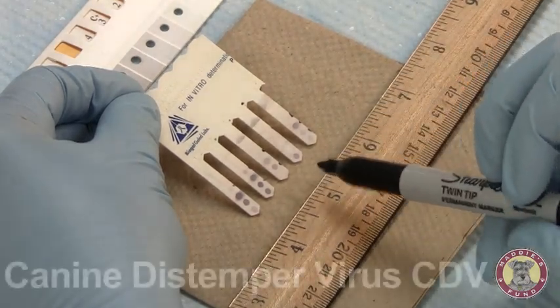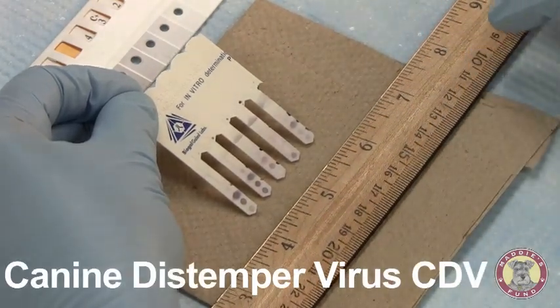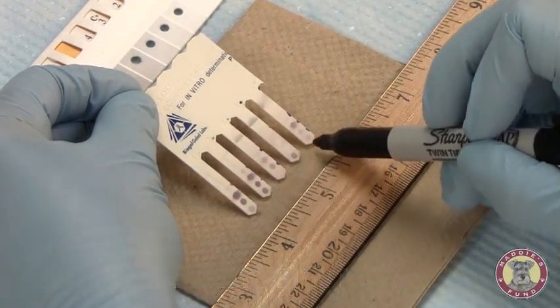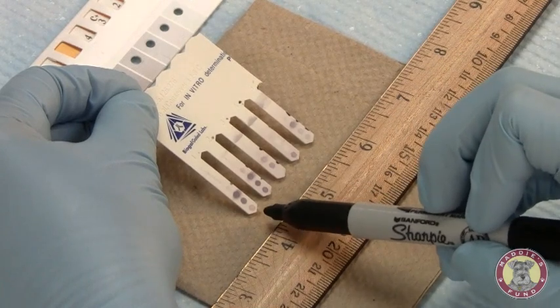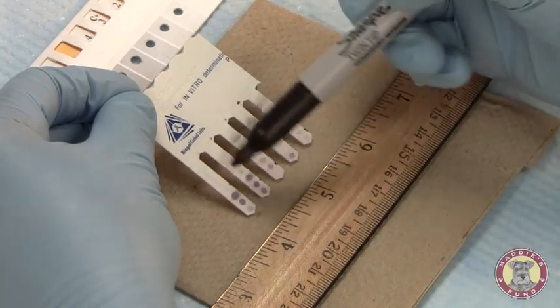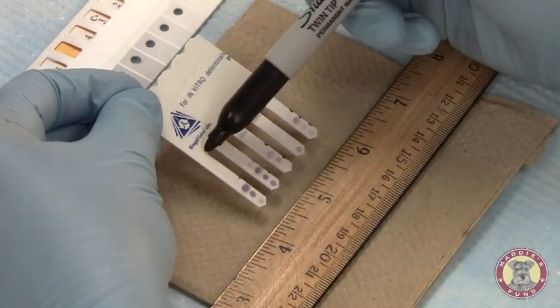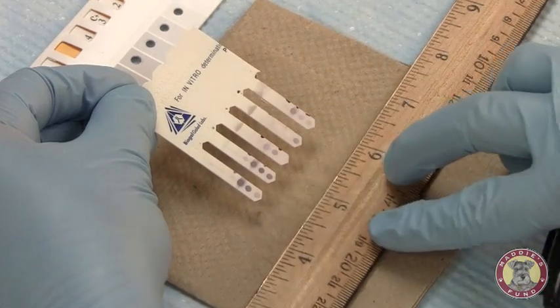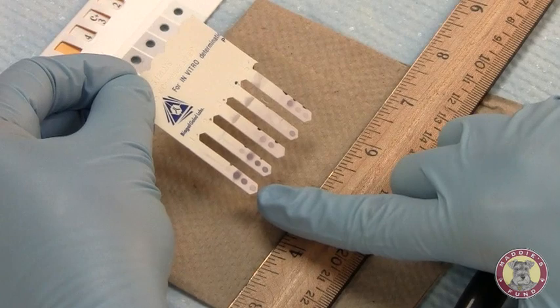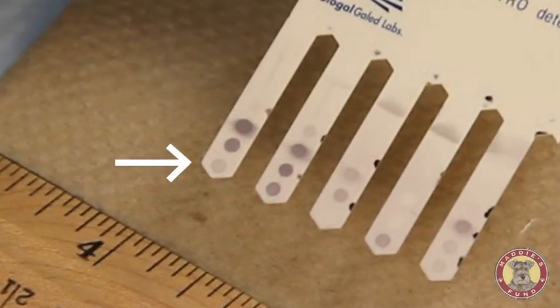The last results will be for distemper — canine distemper virus, or CDV. These color development spots are located at the bottom of the comb. We're going to proceed reading across the comb as in the previous samples. Sample 1, on tooth number 1, we're looking at the bottom dot. Comparing the color development to the positive reference serum — it's slightly darker than the positive. We'll call this a 4.